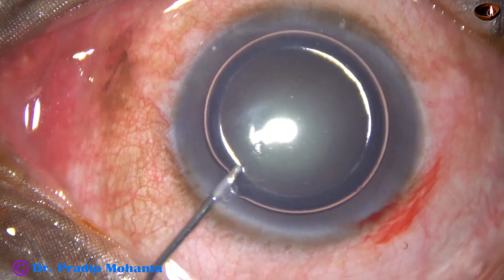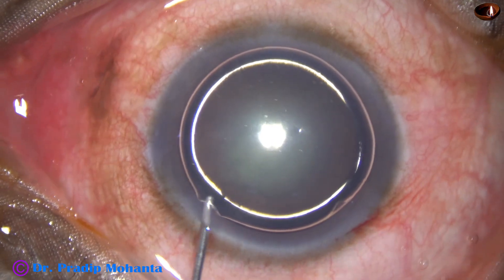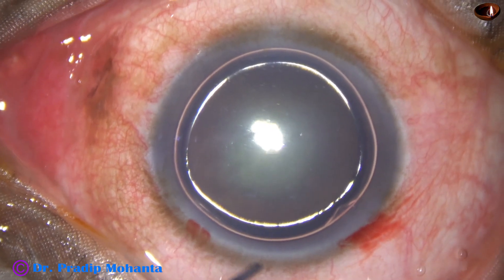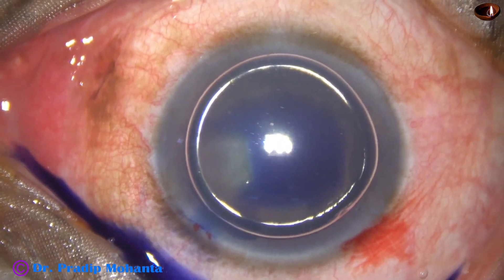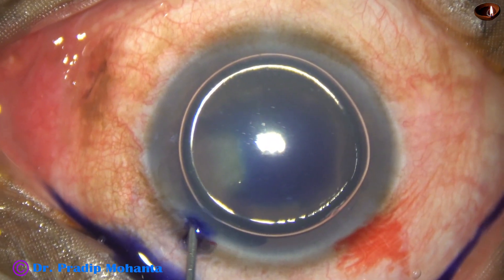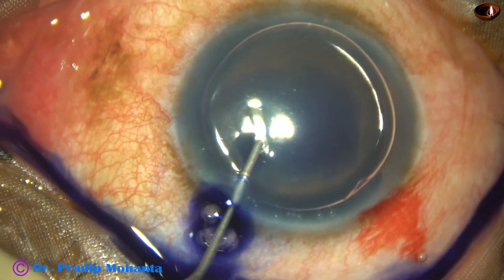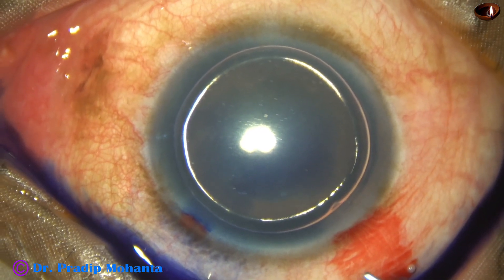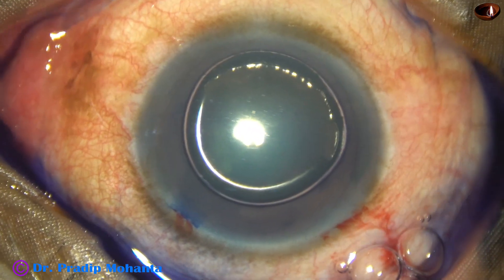An air bubble is injected to fill out the anterior chamber. Beneath this air bubble, trypan blue dye is applied over the anterior capsule to have better contrast and to make the rhexis easy.